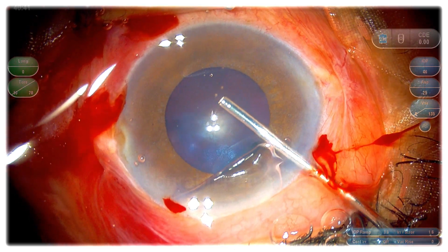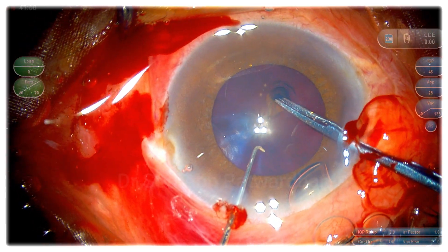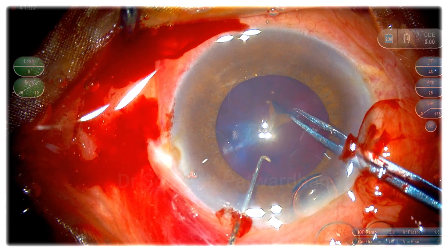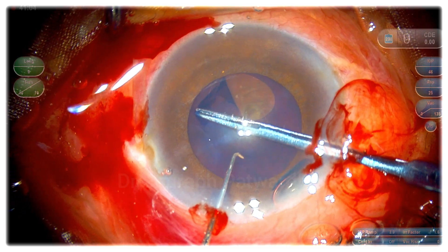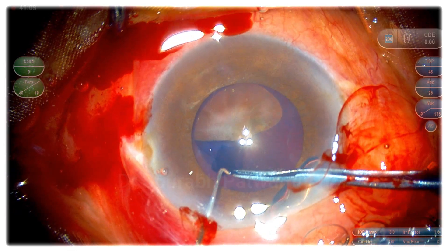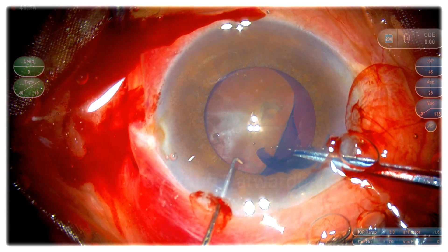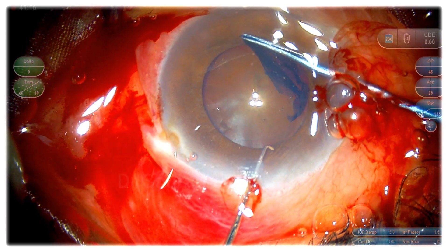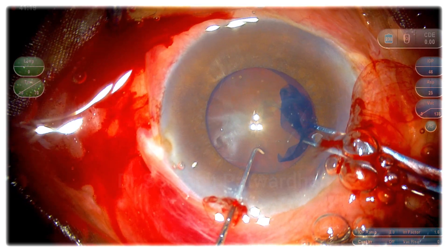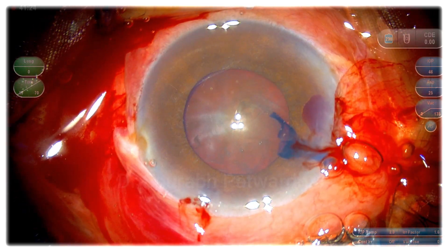Now, here I am already thinking whether I should use a pupil expansion device. But I went ahead with the capsulorhexis. I know that I have to make a large capsulorhexis being a very dense cataract — I want more space for the maneuvers and I don't want the zonules to be affected. You can see that I am targeting almost 5.5 millimeter size. And as I complete it, you can see that the pupil has come down further.